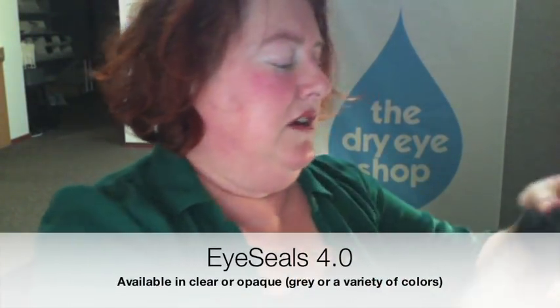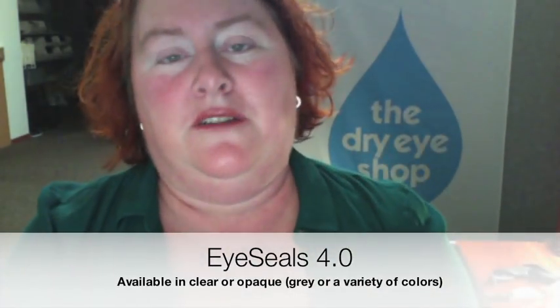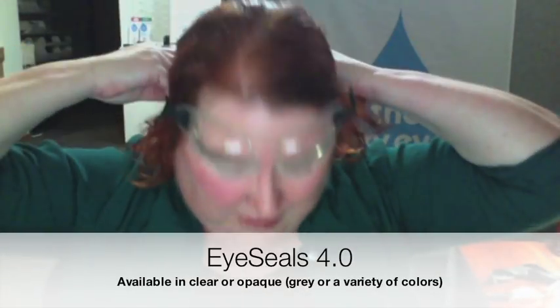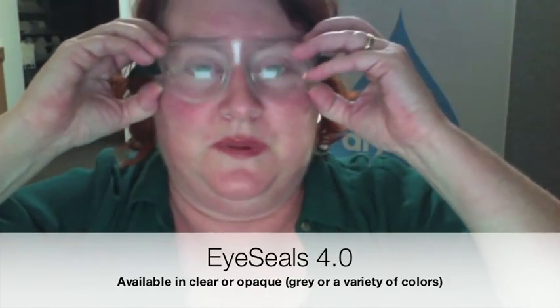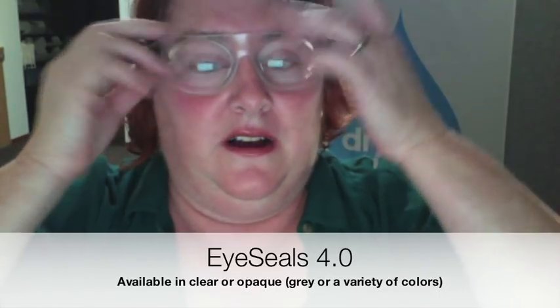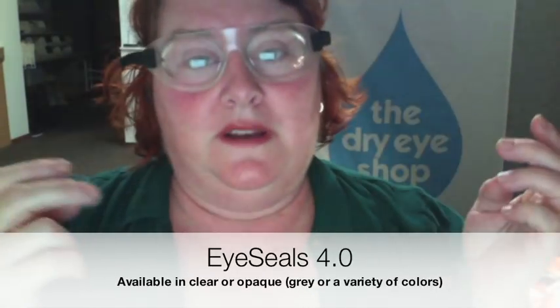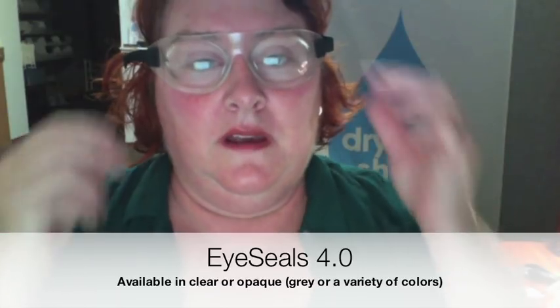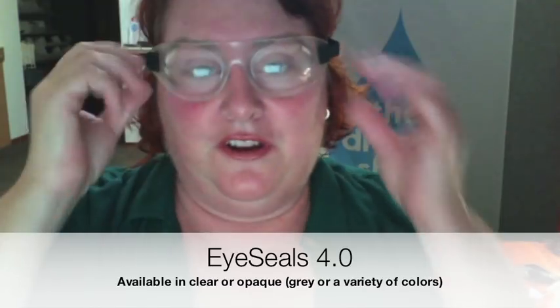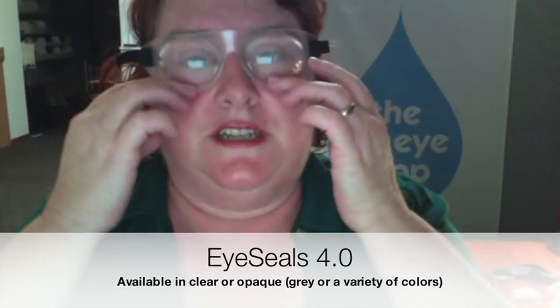The number one of those for the situation where you've got a lot of exposure — unless you have a really tiny face — I would always recommend the Eye Seals 4.0 first. It comes in solid colors, but most people tend to prefer clear so they can get up in the night without having to take it off. On someone like me, this is going to fit almost but not quite airtight. For ladies with very small faces it may be too big and may do some gapping over here.